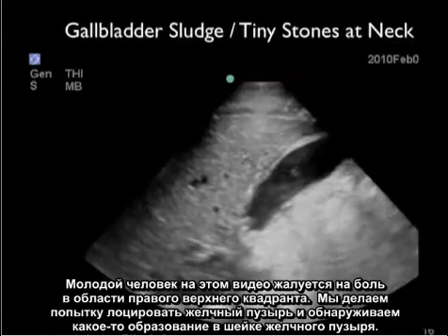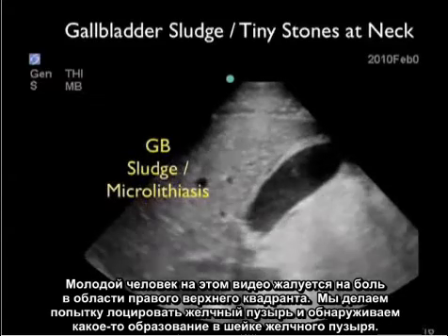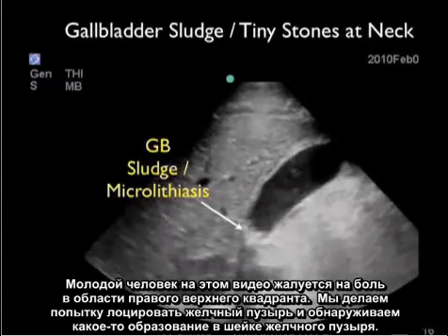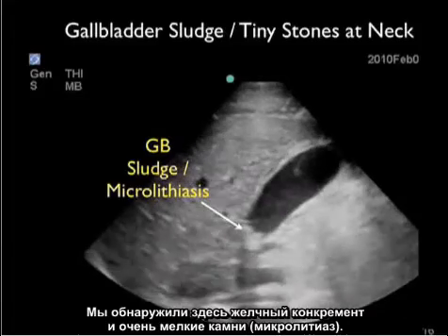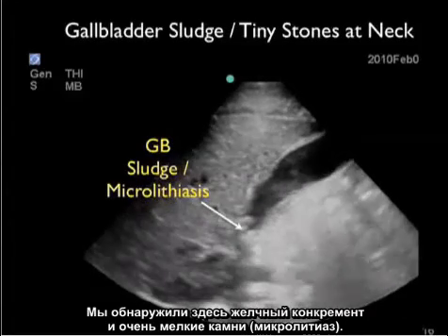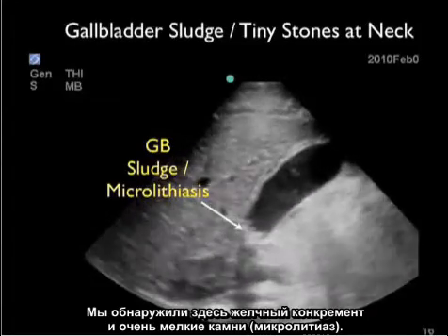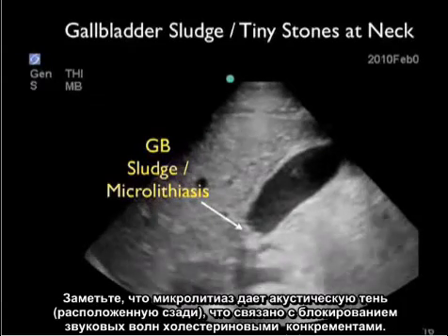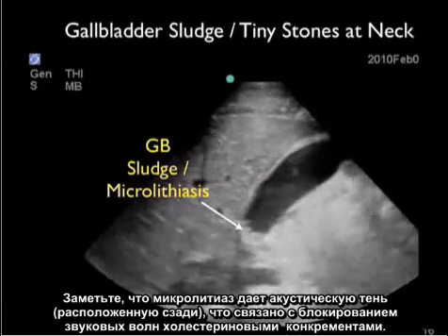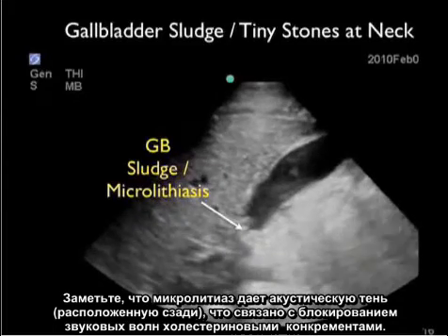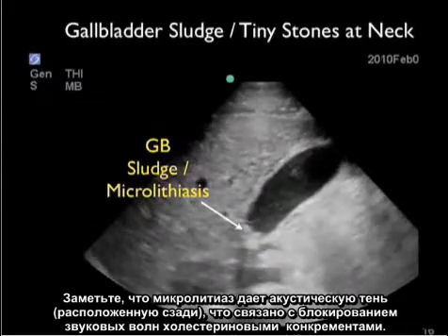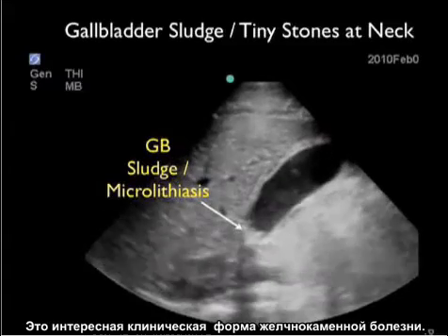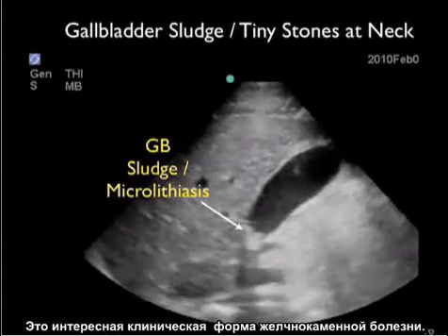Here's a video clip from a young male presenting with right upper quadrant pain. As we're looking through the gallbladder, we notice a finding within the neck of the gallbladder — a concretion of gallbladder sludge and also tiny gallbladder stones known as microlithiasis. Notice that the microlithiasis has posterior acoustic shadowing due to the blocking of sound waves through the concretions of the cholesterol crystals — an interesting finding on the spectrum of gallbladder disease.